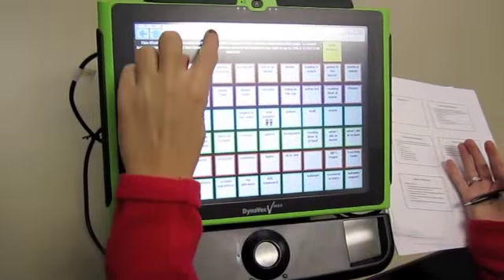And then from there on out, you tell the system what you're making, what kind of remote control it is, like what you're going to do with it. You would choose a name. You'd pick the manufacturer. You'd find the code, kind of like you would program any other new remote that you buy. And then learn each command if necessary. So that's how you do remote control.